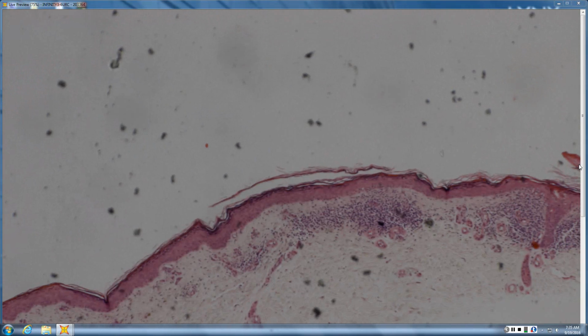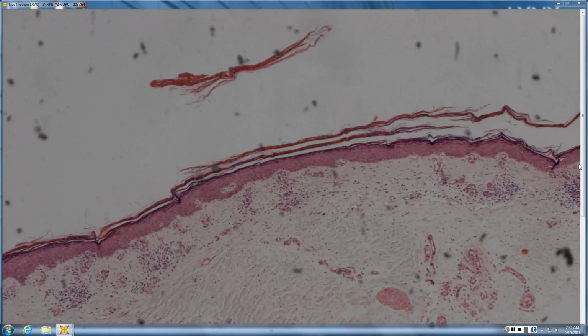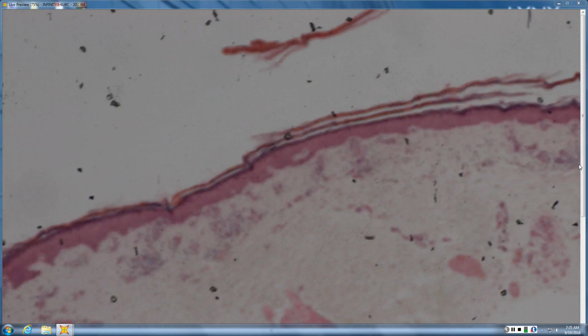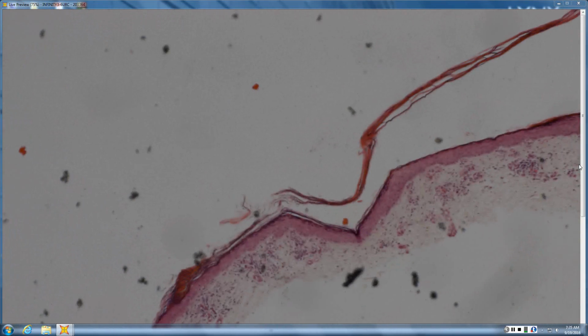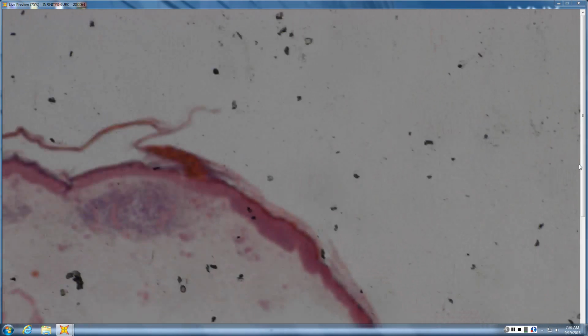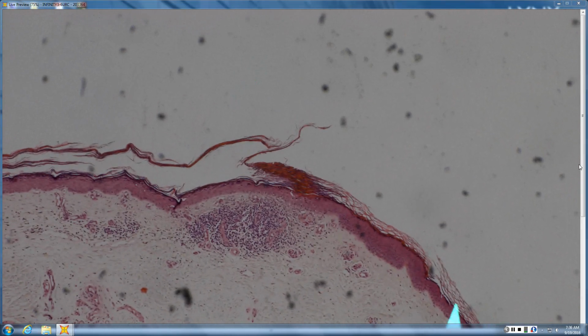So it's kind of a focal dermal infiltrate, kind of around the superficial parts of the hair, in some cases. Definitely not a robust lichenoid infiltrate that I'm seeing now. I mean, it could be a burnout lichenoid, or just a little. Could be burned out lichenoid. Maybe a little vacuolar. Some follicular plugging. Tell me about your corneum.